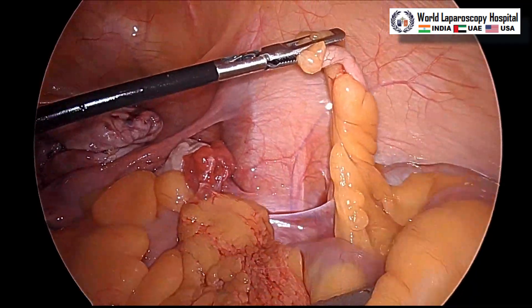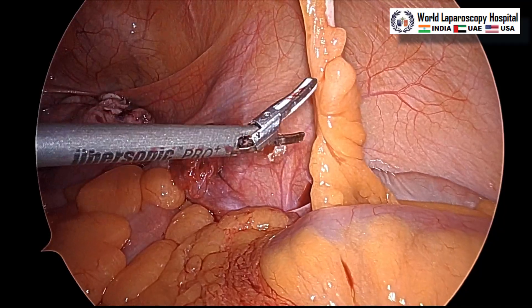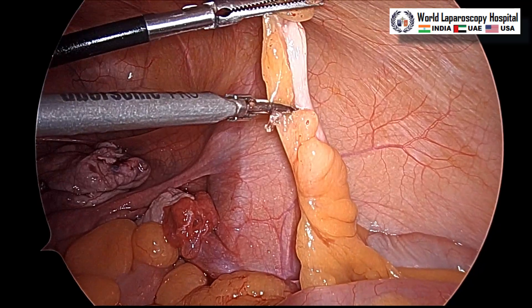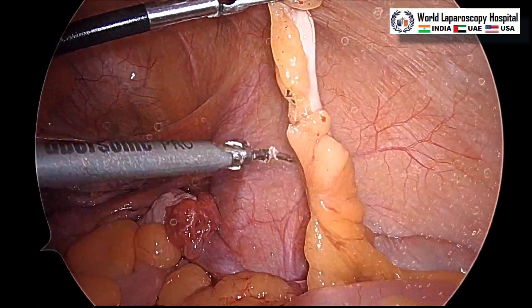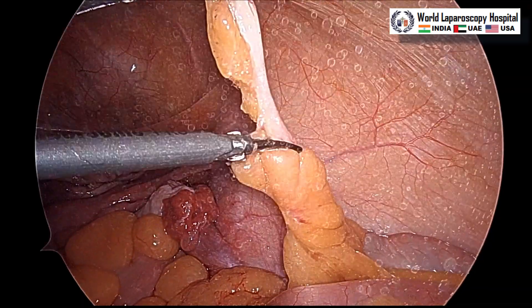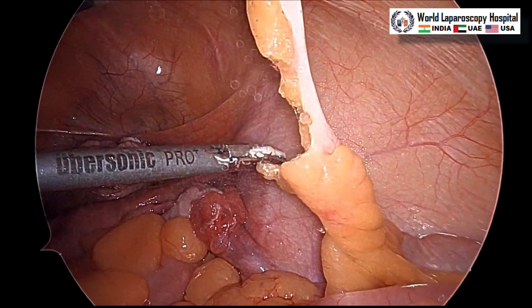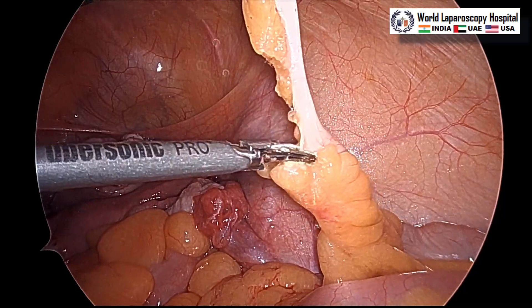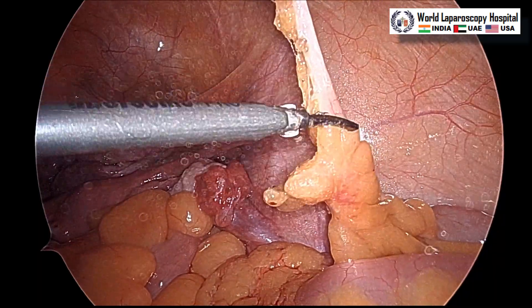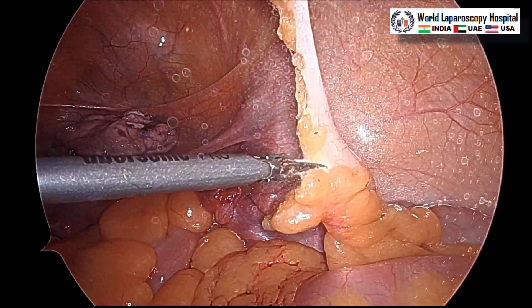With the harmonic we start separating the mesoappendix. It is better to start from the tip rather than going directly to the base, because if you remove all the mesoappendix first, only the thin appendix stalk will remain, making removal through the 10 mm port much easier — you can open the valve and it may come out easily. So slowly separating and reaching to the base of the appendix.